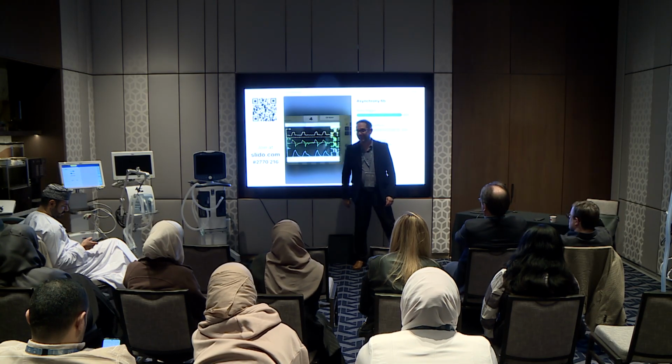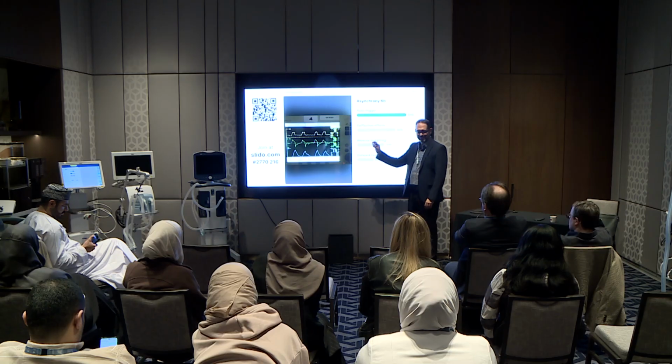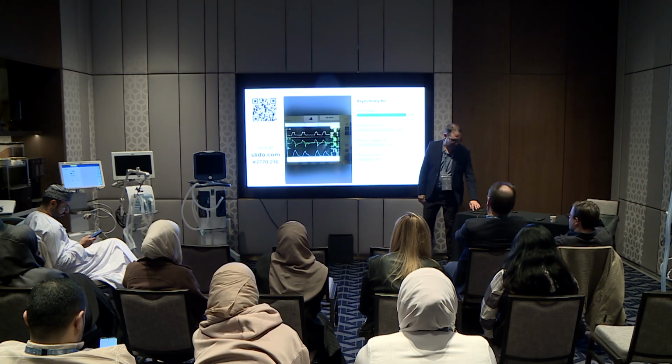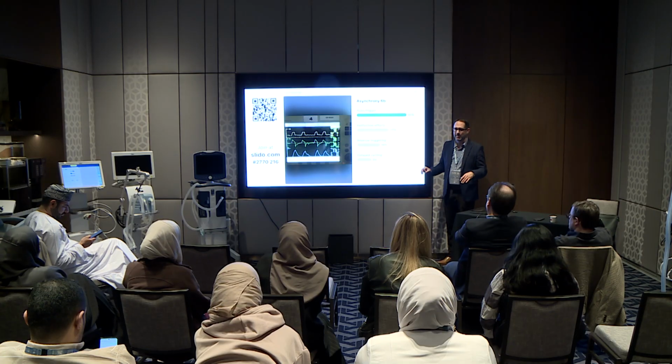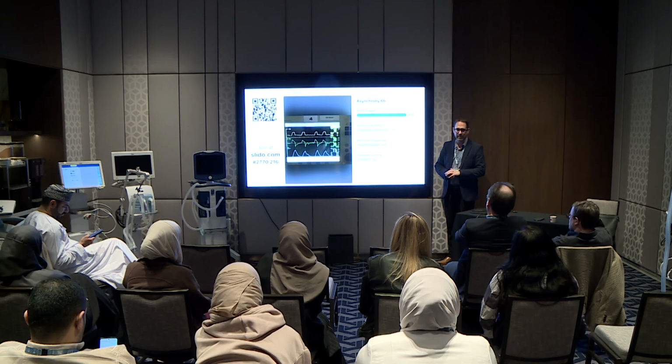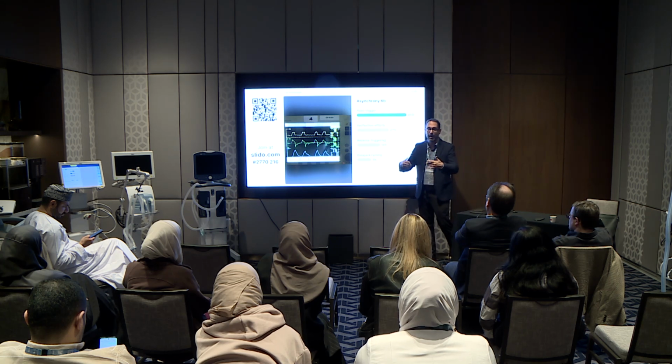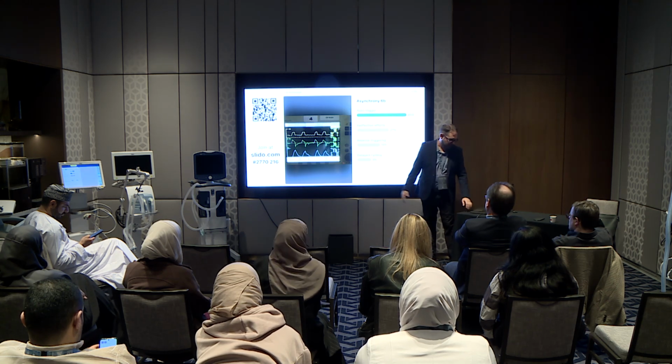So you're not wrong. It wasn't the intended response, but I had the option up there, and I just had to point that out because there have been a few case reports of people describing reverse triggering during pressure support. The only way that can happen is that the ventilator is being triggered by something other than the patient. And in this case, it was cardiac oscillation.